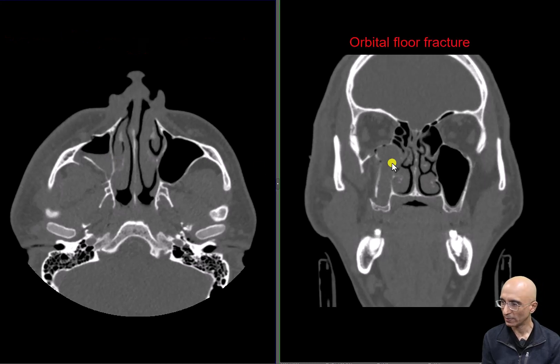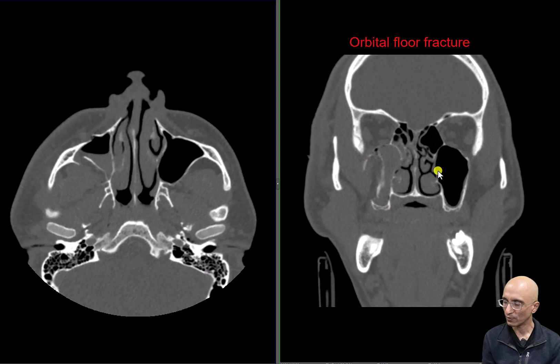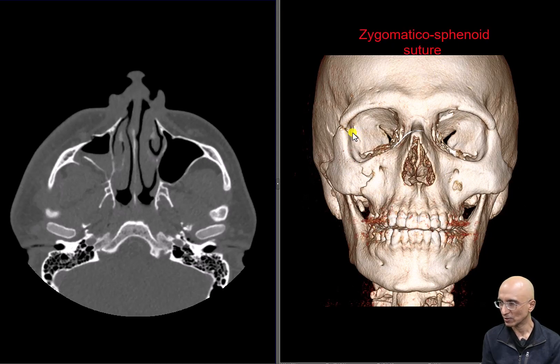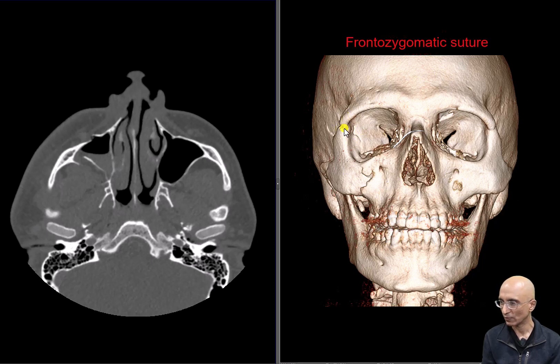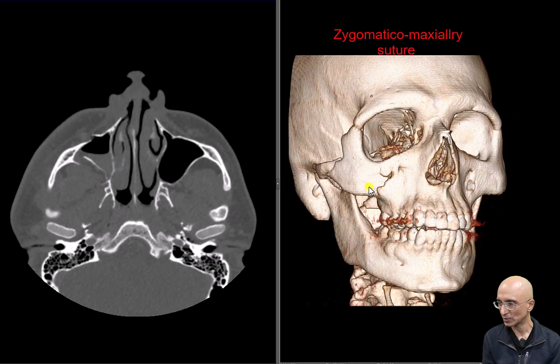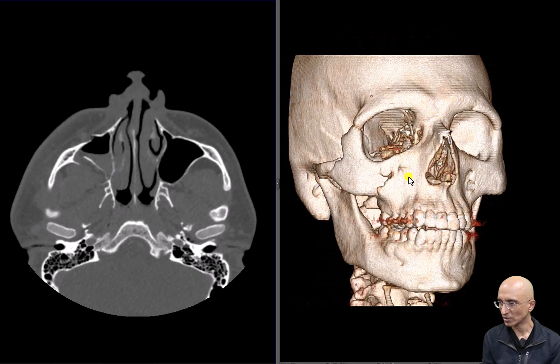On the coronal images, we can see a fracture through the orbital floor. On the 3D reconstruction, the fractures are well delineated. We can see a fracture through the region of the zygomaticosphenoid suture, fracture through the frontozygomatic suture, fracture through the zygomaticomaxillary suture, and fracture of the zygomatic arch.